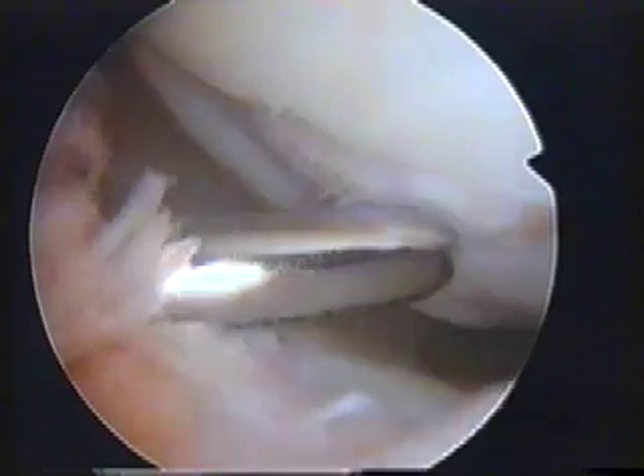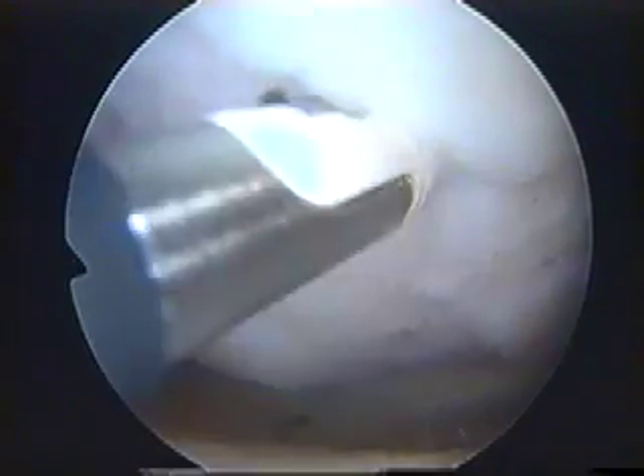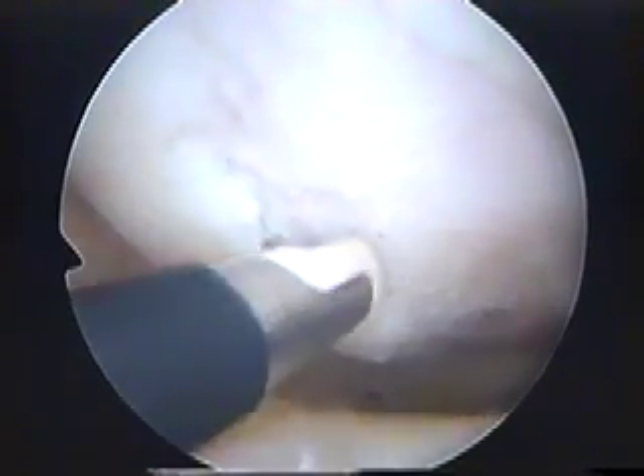I'm using an electric shaver to go around the area of damage, removing the loose material from the edges. We then use this instrument called a diathermy to seal the articular surface. The object of the exercise is to stabilise it so that the amount of debris which is shed into the knee is greatly reduced.